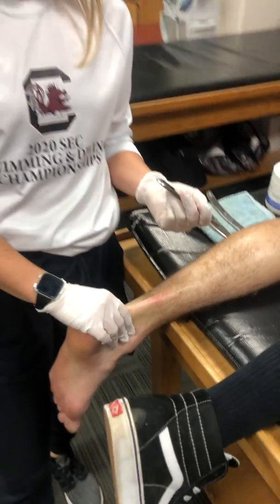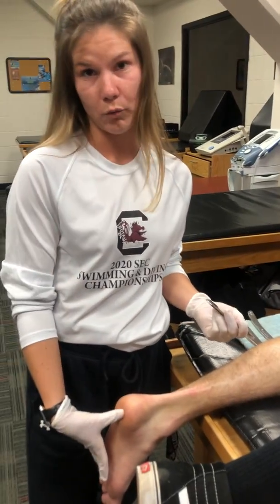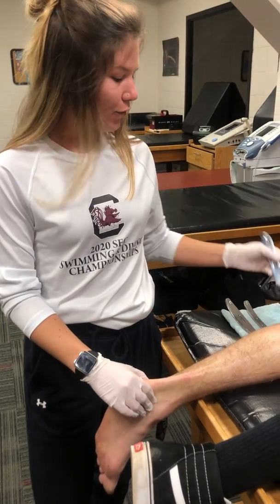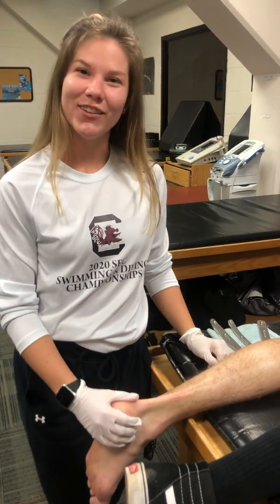For specific injuries like Achilles tendonitis, I would also recommend doing the bottom of the foot as well, but it really just depends on the injury site. Let me know if you have any questions and I'll get back to you — thanks!